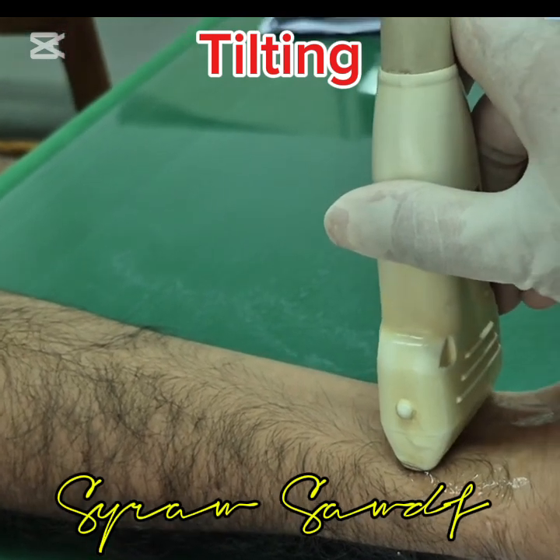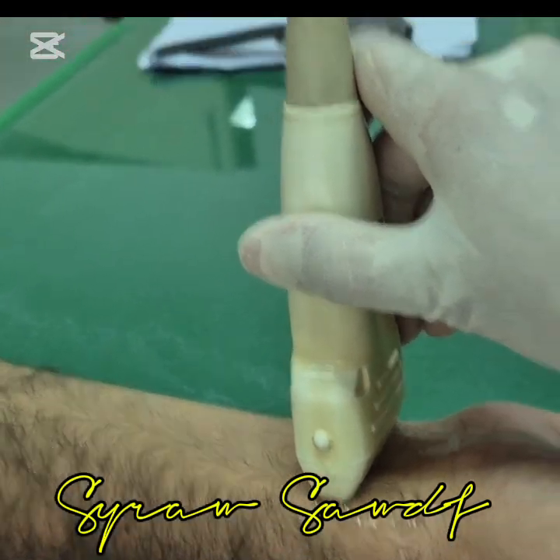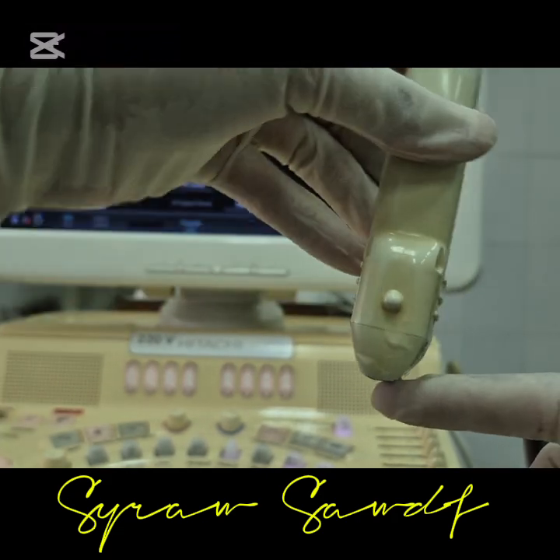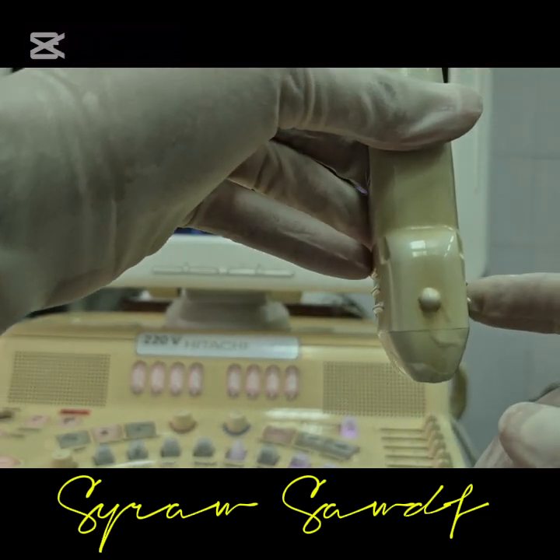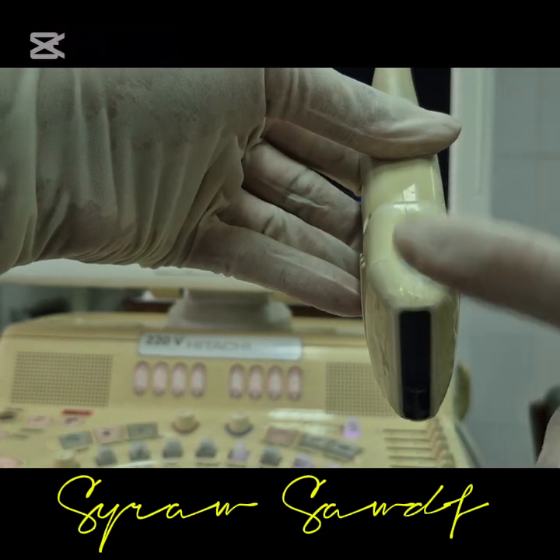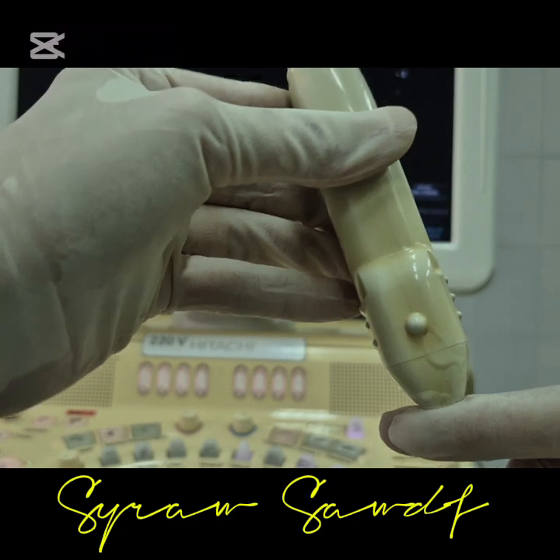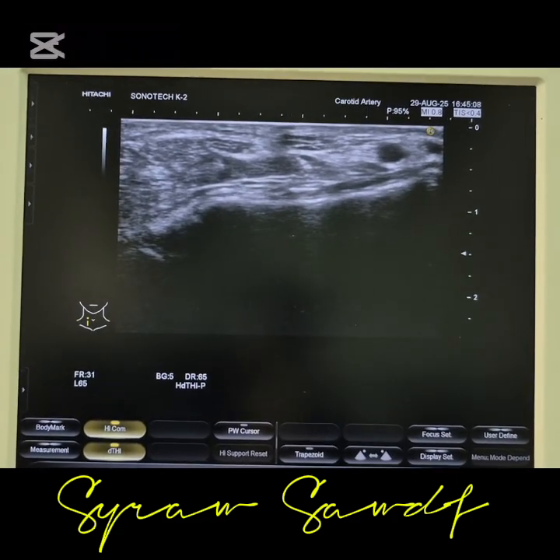And we are doing this movement perpendicular to the direction of the beam of the probe. Now the direction of the beam is like this, transverse, right? We are tilting it perpendicular to the transverse axis. See, so this is tilting. The direction of the beam of the linear probe is in the transverse axis. Can you see? Now we are moving it perpendicular to the transverse axis, keeping the probe in the same place. This is tilting. We do this to have a clear image of the structure we are aiming at.